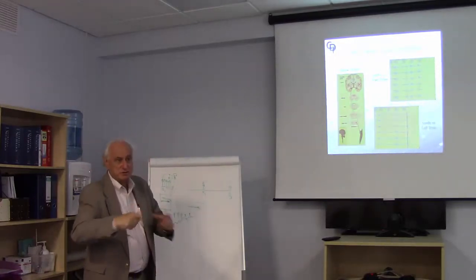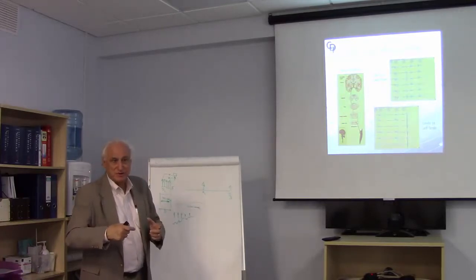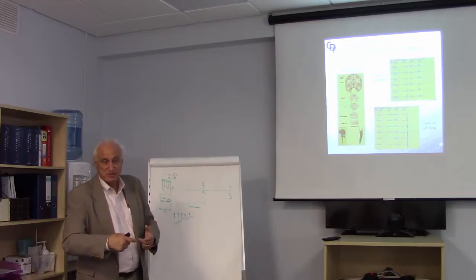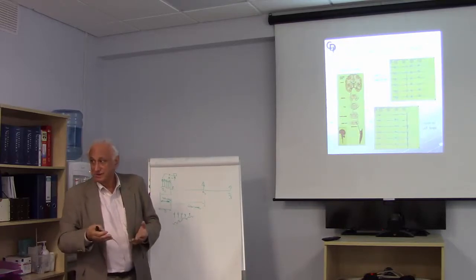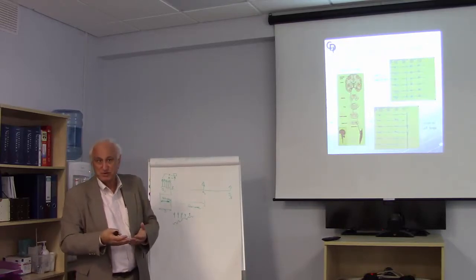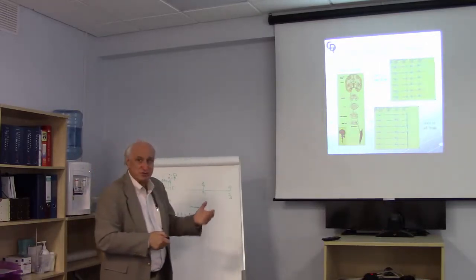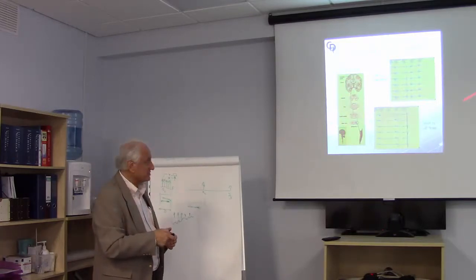By the way, we measure using the 10-20 system, so as good as our measurements are, we're trying to be where the 10-20 system says those sites are, because that 10-20 system actually is a fairly good representation of where the underlying brain structures are. Not perfect, but good. So we actually do measure this, we just don't stick them on and hope we're in the right place. And that's an important thing.